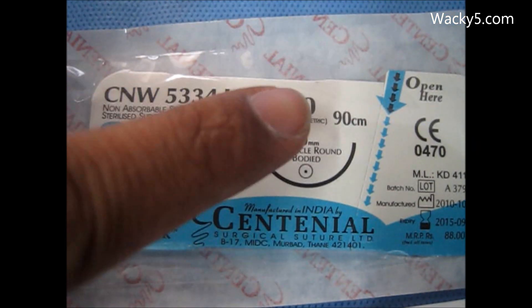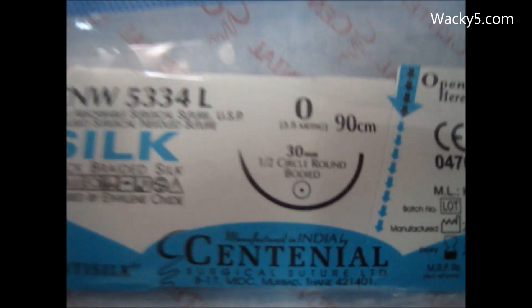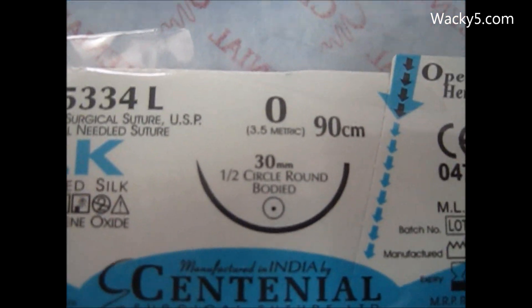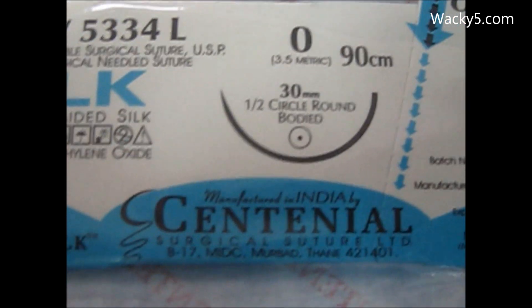Here you can see a small size needle, and the size of the thread or suture depends upon this. Now see a graph here. As you can see, the numbers from 0 to 7 increase in size, and when attached with 0, their size decreases. So 2-0 and 3-0 — 3-0 will be more finer. 9-0 is further more fine as compared to 0, 1, 2, 3, or 2-0.